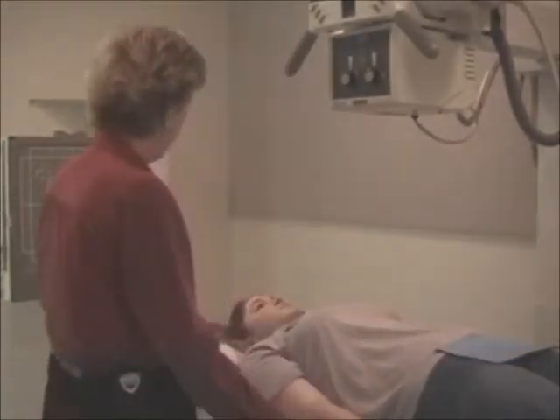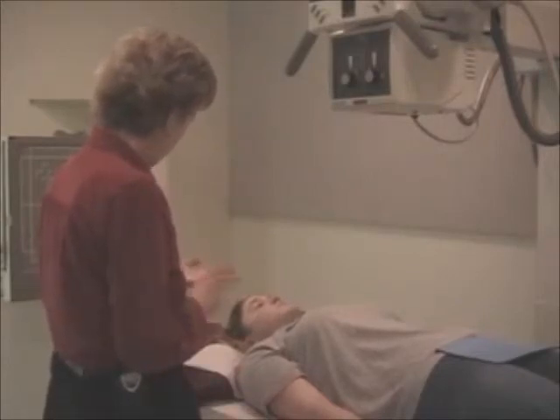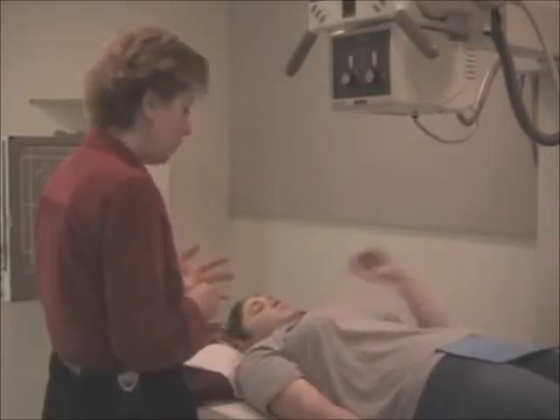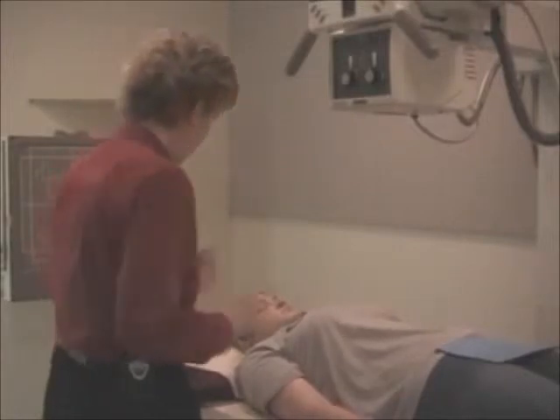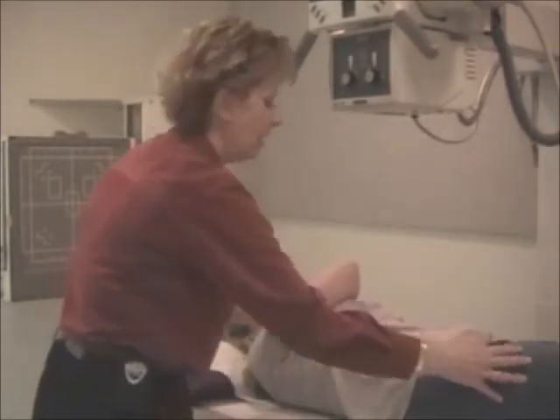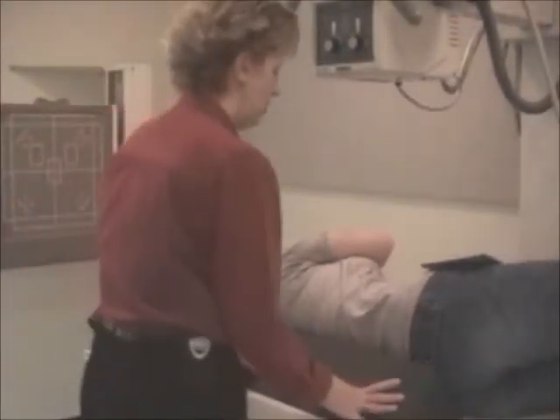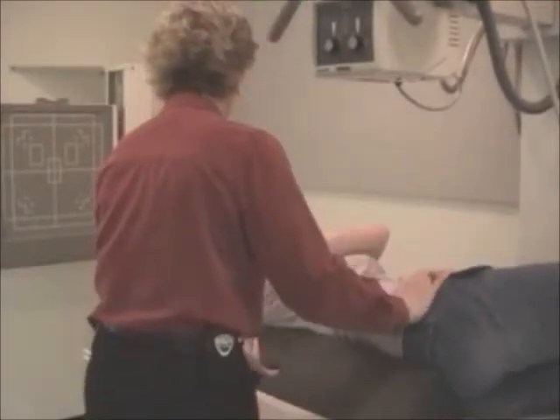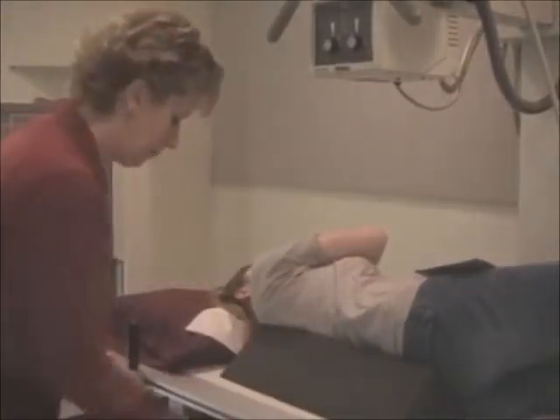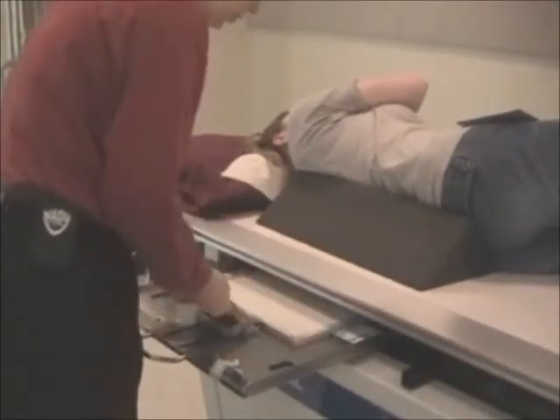Kristen, the only one I think we have left is an LPO. We did an AP and a PA. We did an RAO. We did the right and left lateral, so an LPO. Okay? We're going to bring this arm over your chest. Just bend the knee slightly, and we're going to roll you like a log. 30, 45-degree obliquity again. If they have troubles holding in place, don't hesitate to use a positioning sponge. Is that more comfortable? Yeah. Cassette will go lengthwise. ID to the top.